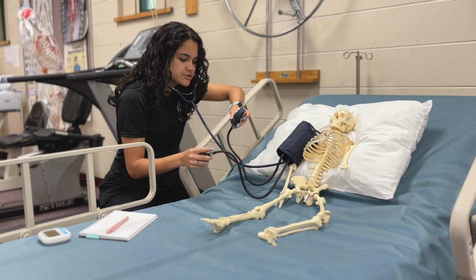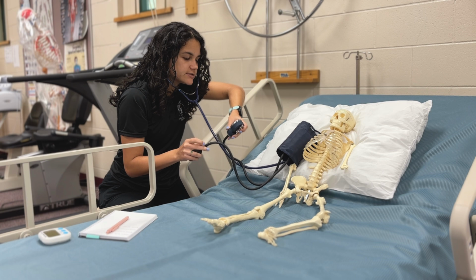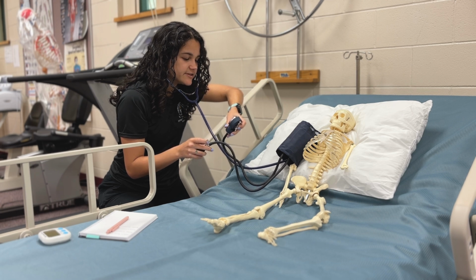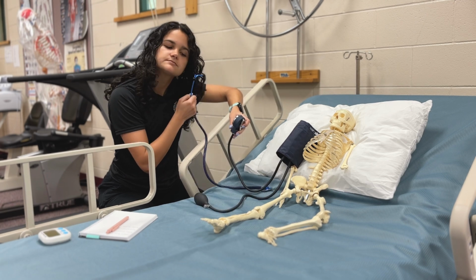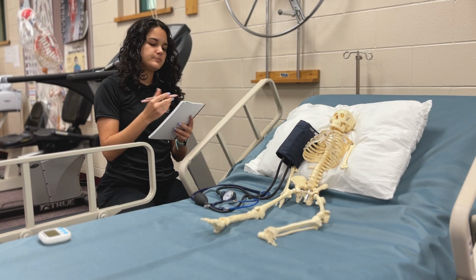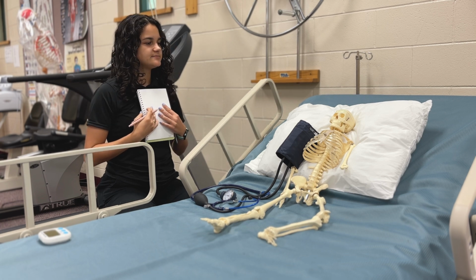Looking at my gauge, I squeeze appropriately, and I'll slowly decrease that pressure. First number I hear is the systolic. And then after, I hear the diastolic. All right, Mr. Skella, your blood pressure is exactly 0/0, as expected.